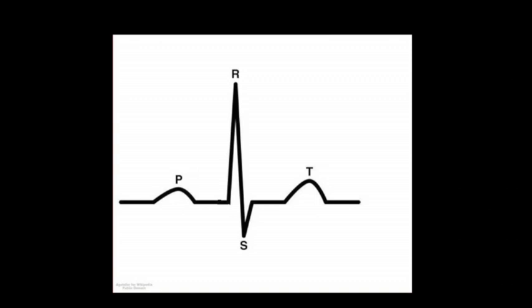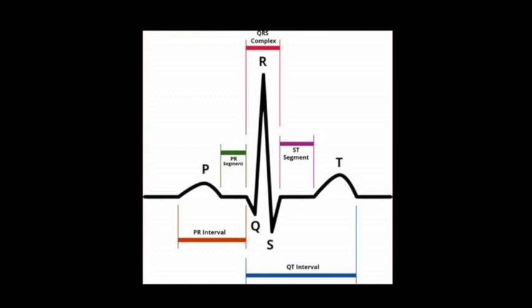Just like the waves on an EKG are given names, the segments in between the waves are given names as well. The segment that will be most important for this topic is the ST segment.